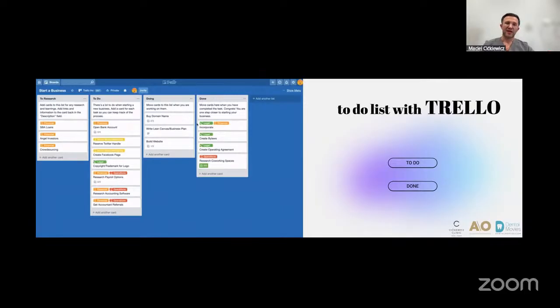So right now, I would like to give you options to think that sometimes the software of the production of the aligners is not complete, because it's difficult to assess the information about where you are in the process. So we are using different software to have the finalization of our production.